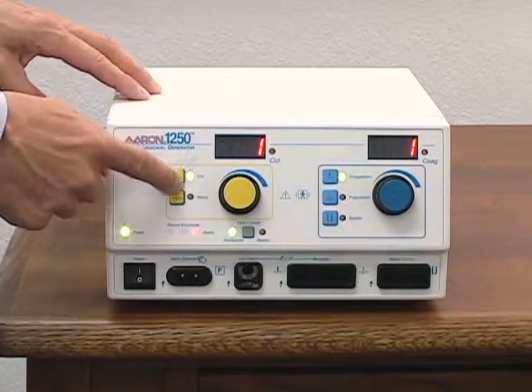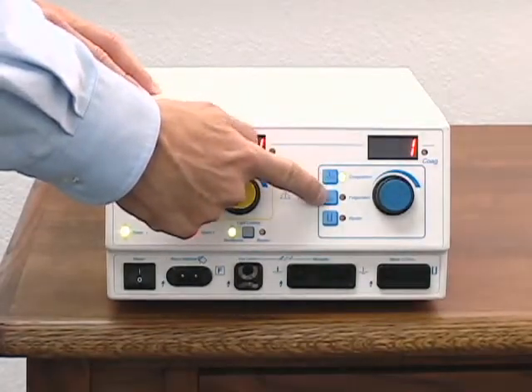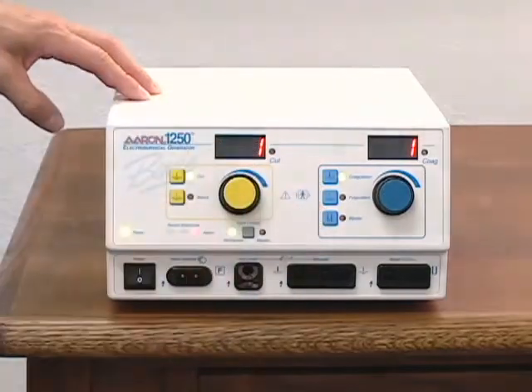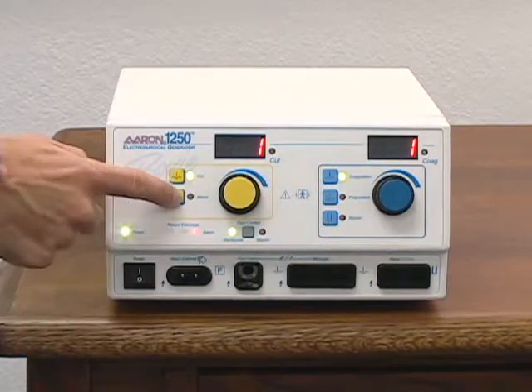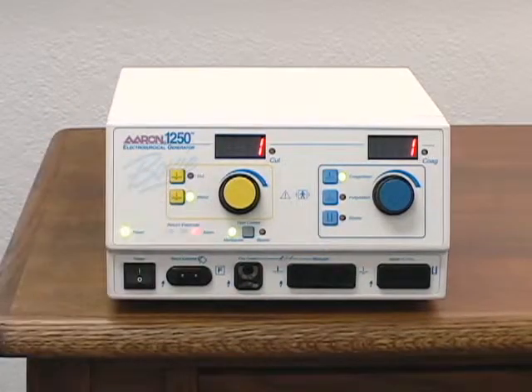The Aaron 1250 has five operating modes: cut, blend, coagulation, fulguration, and bipolar. To select an operating mode, simply press the button indicating the desired mode. To adjust the power, rotate the power control knob to the desired setting.